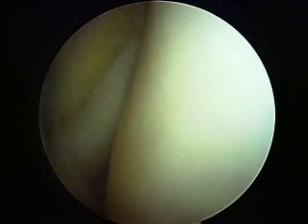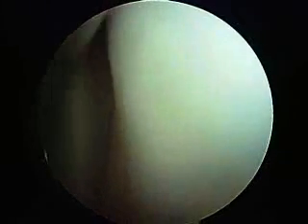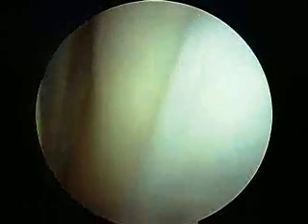When I lift this up, you'll see a tendon going obliquely from about the 4 o'clock position to the 10 o'clock position. That right there is called the popliteus tendon, and that's intact, so that's normal. That's your lateral compartment. Here's your lateral femoral condyle, and that all looks good. Now we're going to come into the intercondylar notch. This is where your cruciate ligaments are, the anterior and posterior.